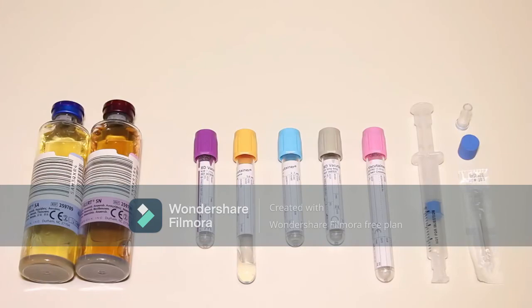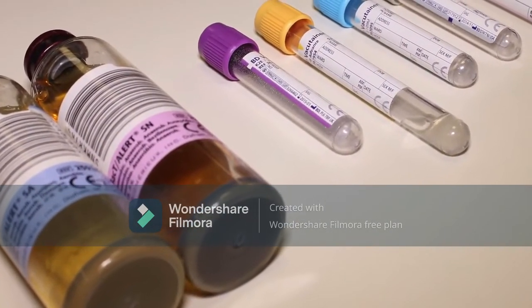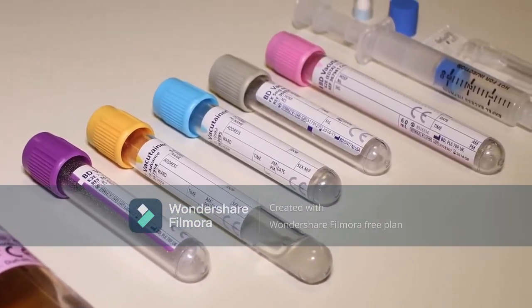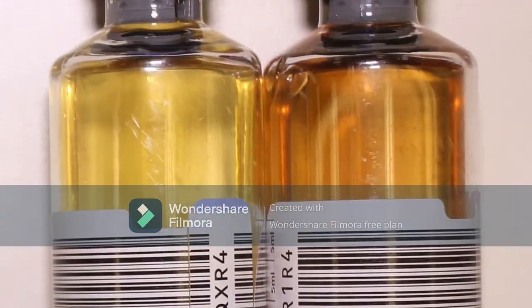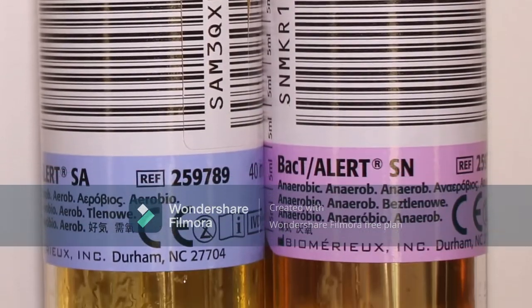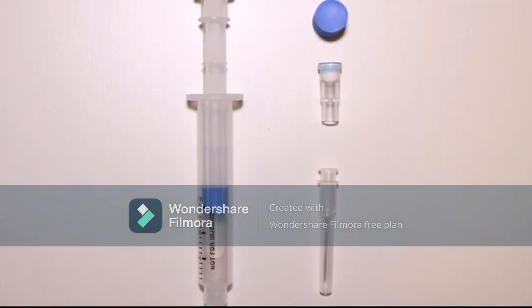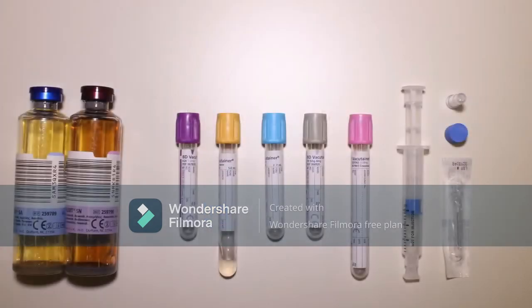More commonly used blood bottles and blood tests. It's intended to help you understand which bottles are used for which tests, so that you can choose the appropriate equipment when you land on the wards. We're trying to give generic information, but don't forget equipment and protocols may vary between different trusts.